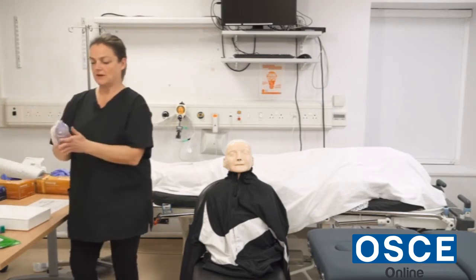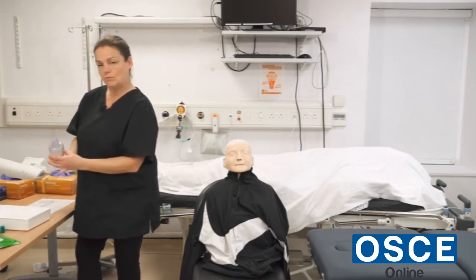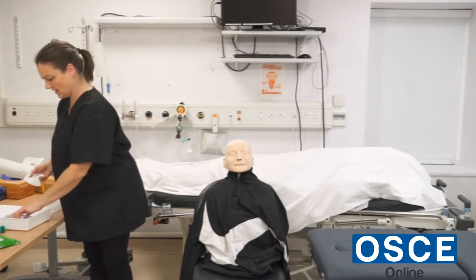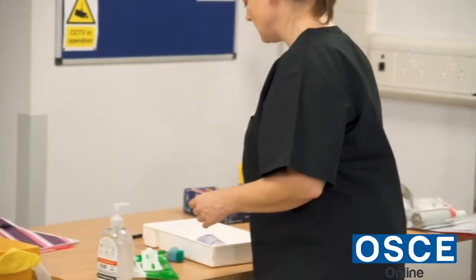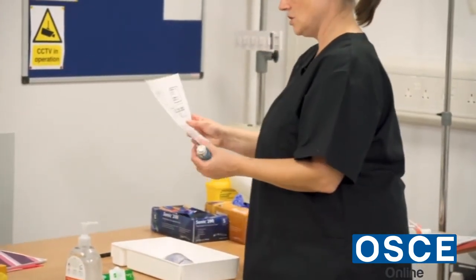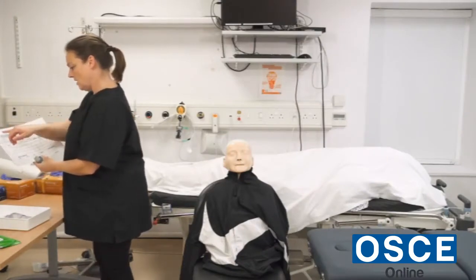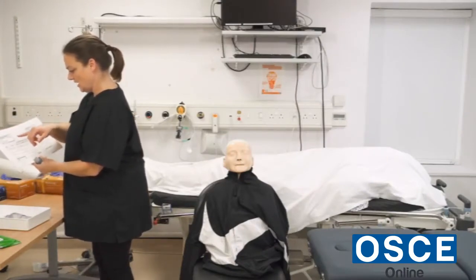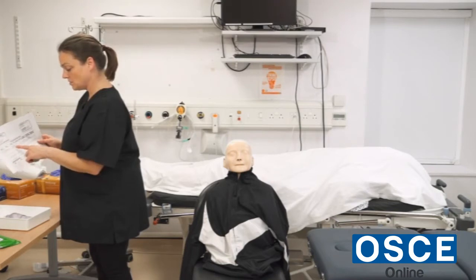So this is the spacer device. Because it's out, I don't know how long it's been out and when the last time it was washed, so I'm going to give it a clean. Again, that will just go into his domestic waste. And I would check the medication chart. So I've got Peter McNamali. It's the right address. The drug is salbutamol. So it's the right drug. I know I'm coming to give him salbutamol.